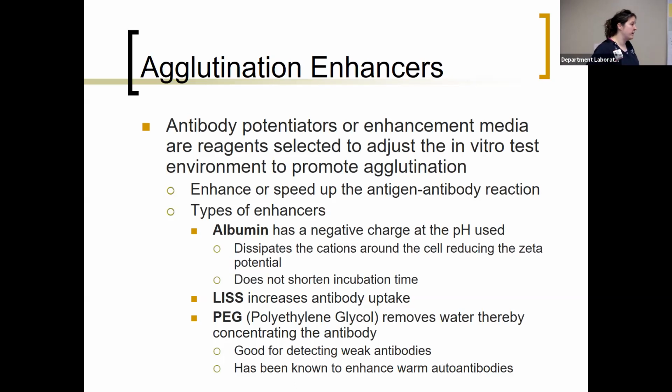It has been my experience when I was working in blood bank that we did not use any of these enhancers. And if you ask me why that is, I would say that the manufacturing process of blood bank reagents has improved drastically over time, and so these typically aren't needed anymore.